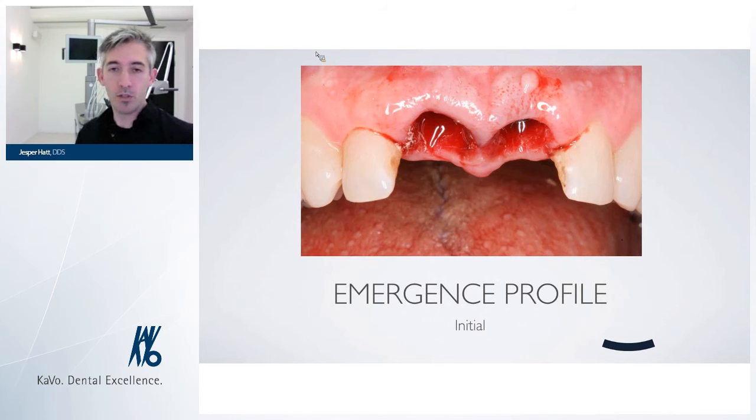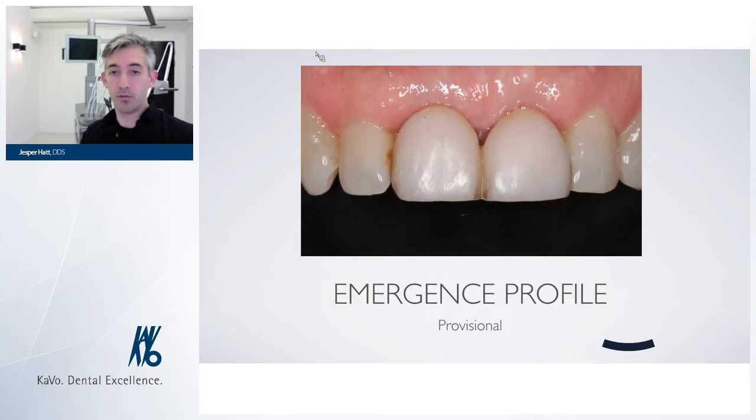Oh, sorry. So we made a provisional. This is, I think, 2 months post-operatively. You see a nice soft tissue healing. There's enough space for the soft tissue to heal and to swell and to shrink again, in a way that it doesn't get inflamed.